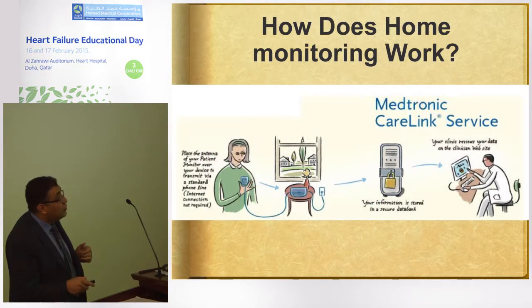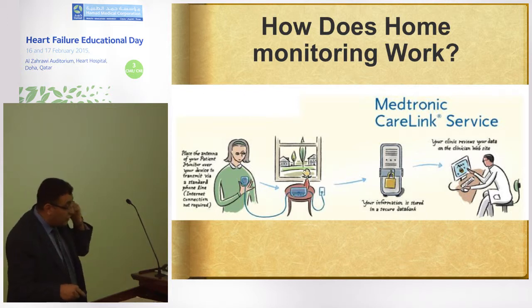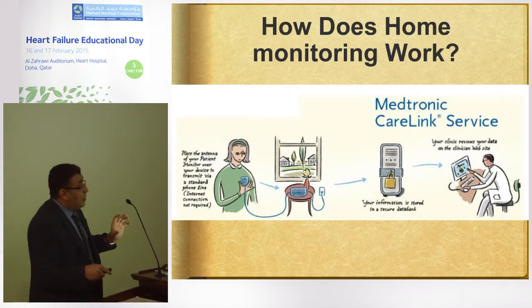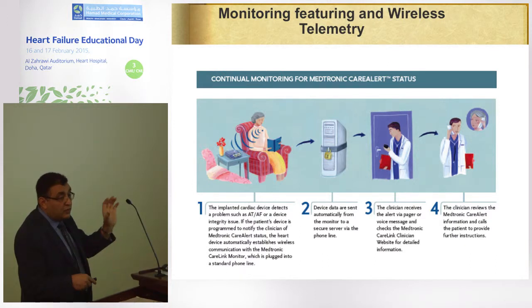So this is a cartoon of how this home monitoring works. This is the patient at home. This is the CareLink, or each company has a different system. There are two ways, or it could even be wireless to the patient itself. And this is done on a daily basis.